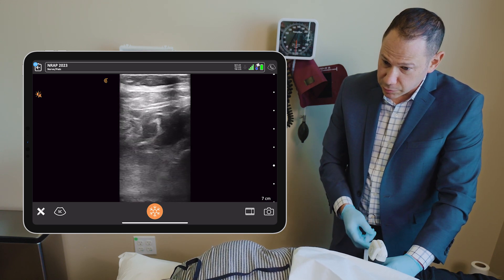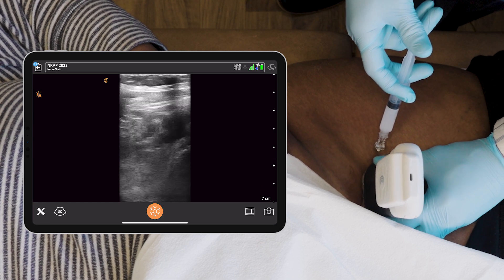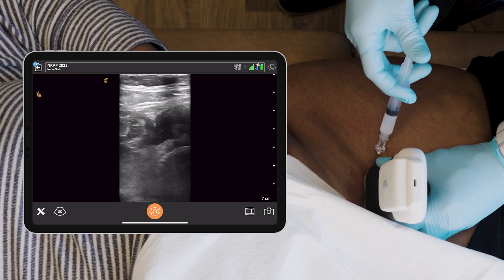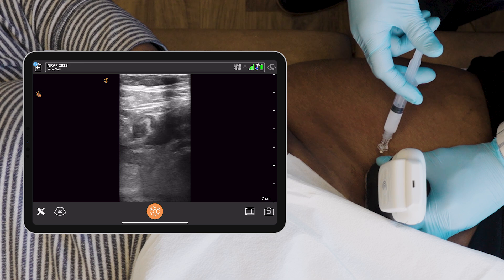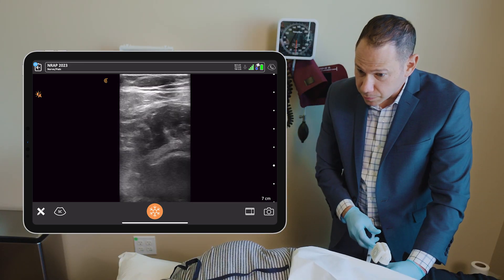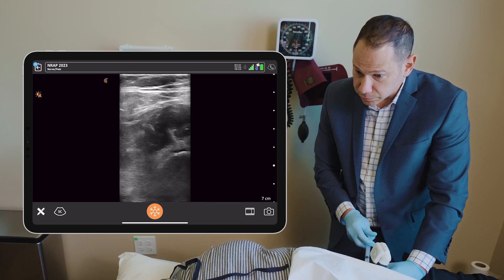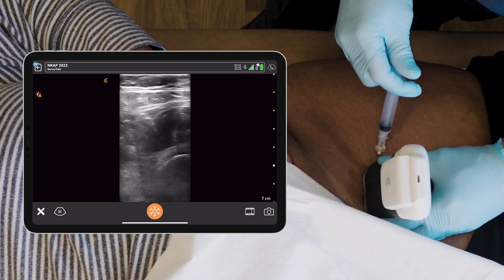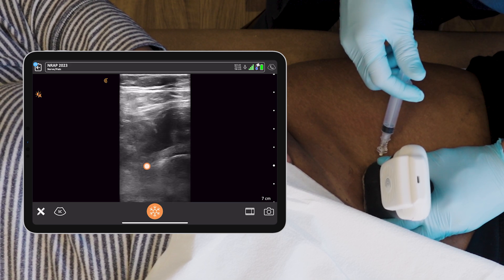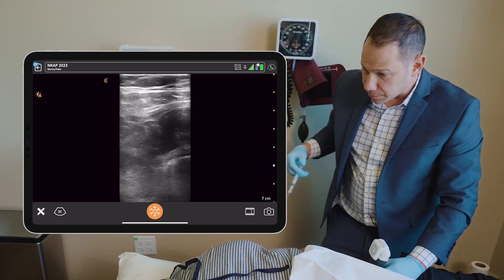I'm going to aspirate and inject. My needle's on the bone, under the capsule. And I'm injecting. You can see a little air going under the capsule above the periosteum. And we're done.